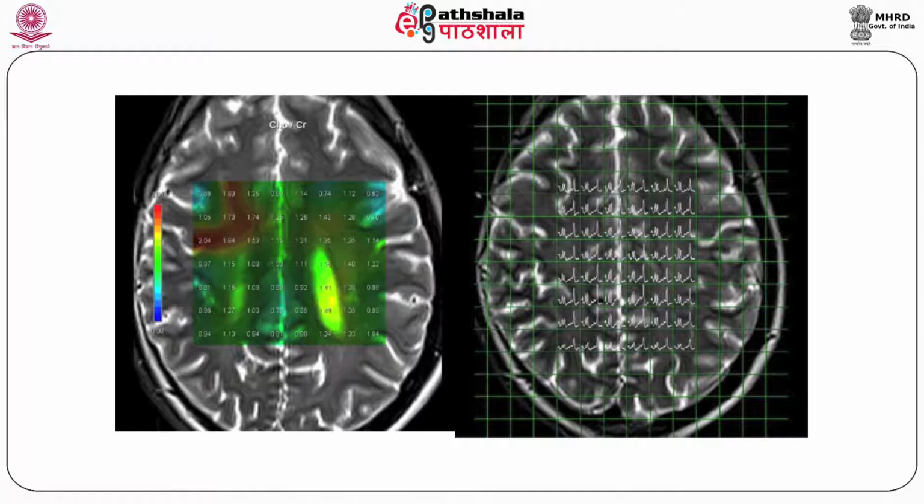This can be done by two methods. One is CHESS, chemical shift selective excitation, the most frequently used technique. Water signal is eliminated using one or more 90-degree pre-saturation pulses centered over the water resonance frequency. Or we can use water elimination Fourier transform techniques, where a 180-degree pulse is centered over water. This is slightly less efficient than CHESS for water suppression.